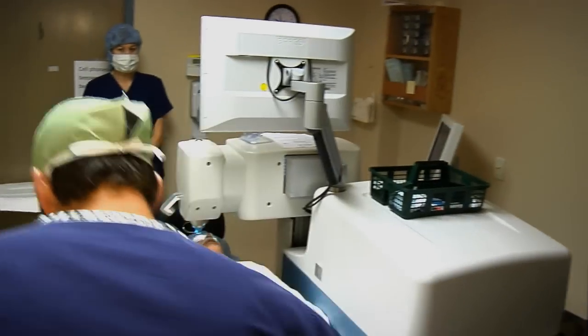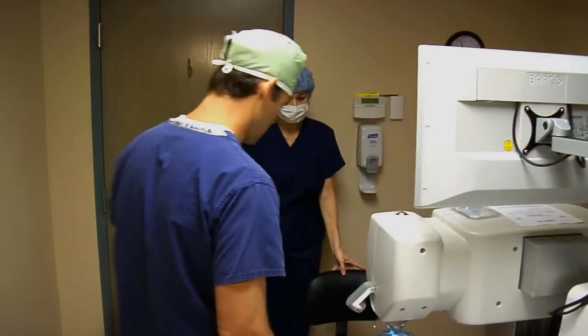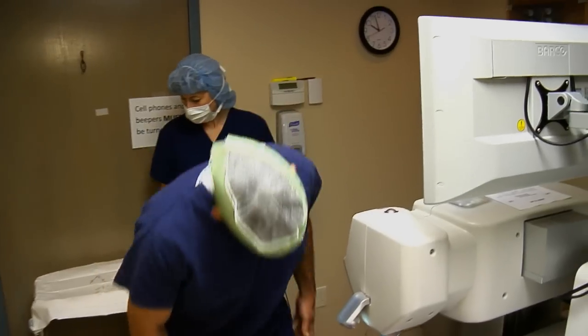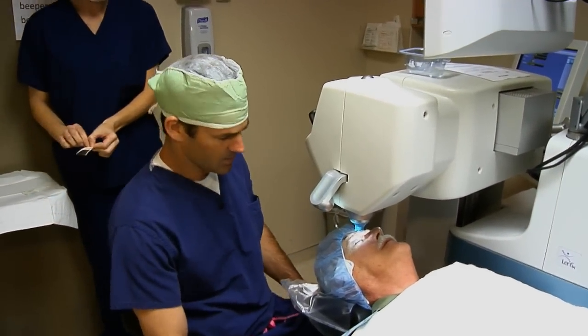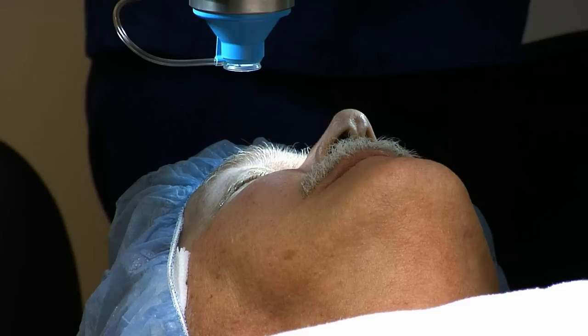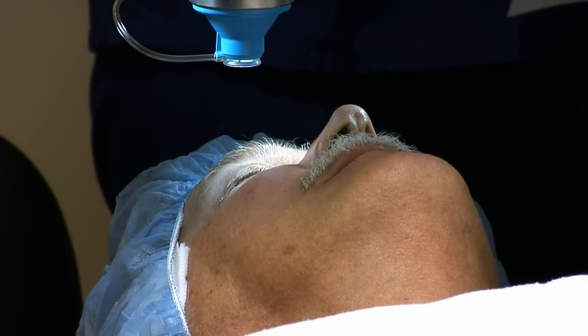Mr. Snedler, how are you doing today, sir? Very well, and yourself? Excellent. So it looks like the left eye turned out great for you. Yes, sir. Alright, we're going to do the same thing with the right eye. You know what to expect here, but we'll talk you through it all.